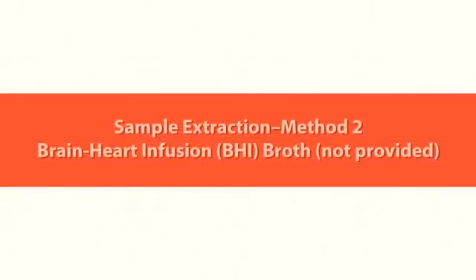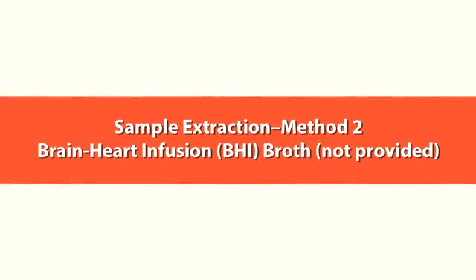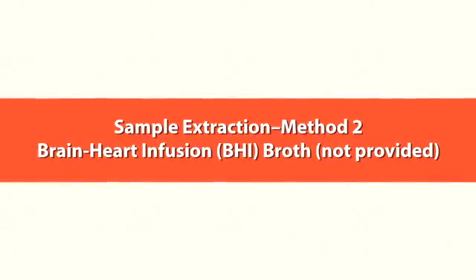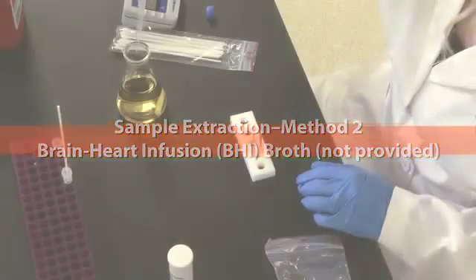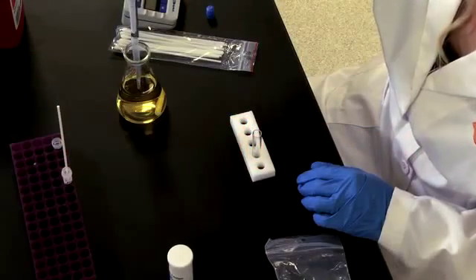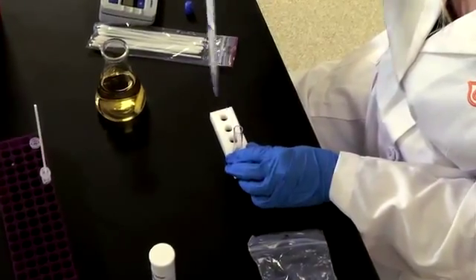The second extraction method is using brain heart infusion or BHI broth, which is not provided. Please also see your directional insert for a list of additional viral transport media alternatives. To begin the BHI broth process, first place approximately 500 microliters of BHI broth into the test collection tube.